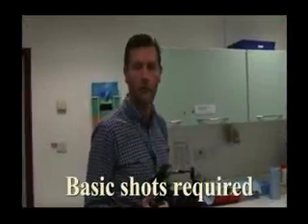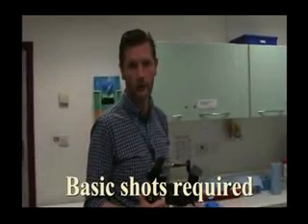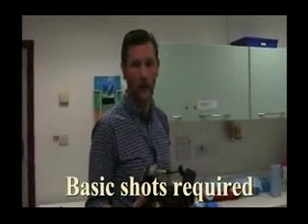Okay, I'm going to go through the basic shots that you're going to use for close-up dentistry. I'm not going to be talking about full face photos.